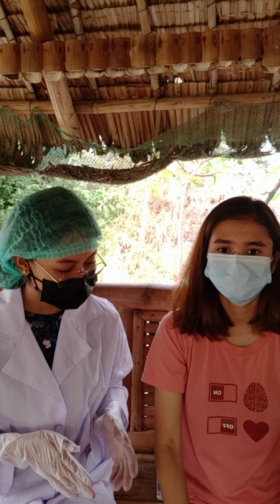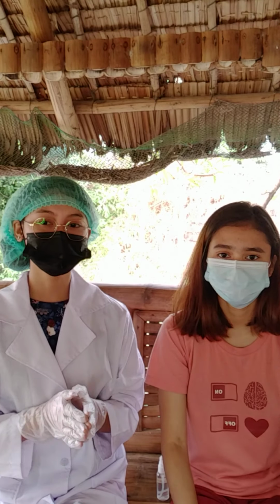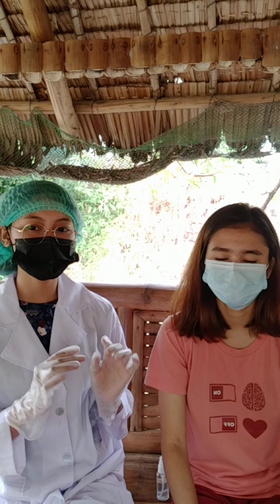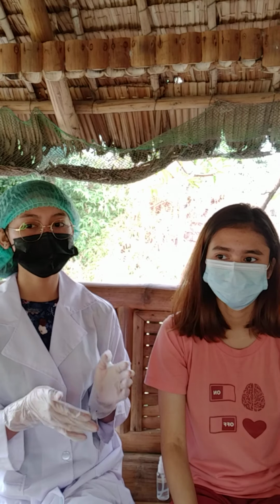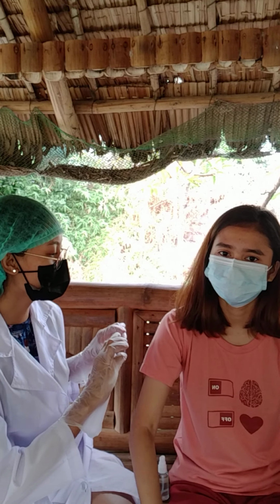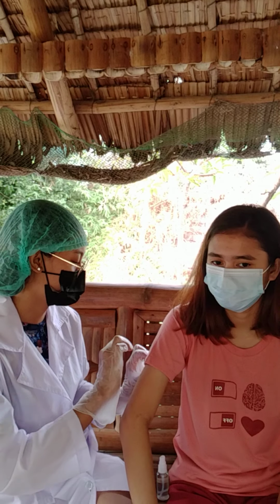So, check lang po natin, ma'am, kung naka-uncross po yung paa niyo. Dapat din po naka-uncross. Then, after that, expose the brachial artery by removing garments or moving a sleeve if it is not too tight above the area where the cuff will be placed. So, ma'am, i-roll ko lang po itong damit ninyo para po masimulan na po natin yung blood pressure po.